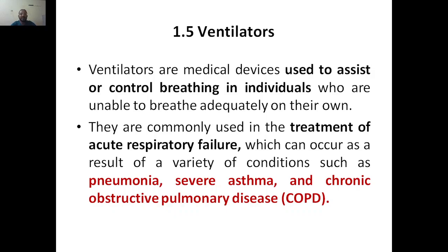So ventilators are medical devices. They are used to assist or control the breathing in individuals who are unable to breathe adequately on their own, right? So whenever your lung cannot function properly, you are going to experience difficulty in breathing, and if there is difficulty in breathing, then there is no oxygen supply to every part of the body, so it will collapse.